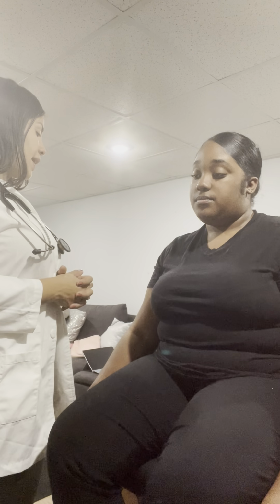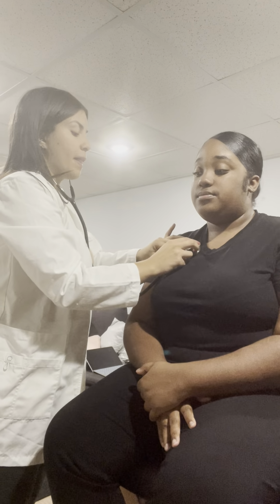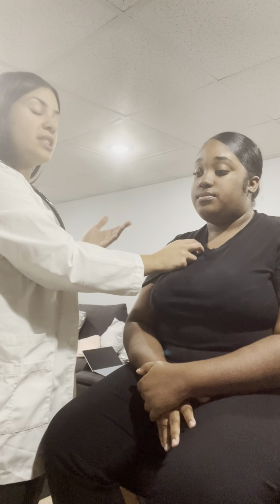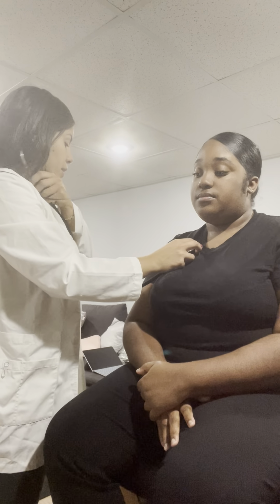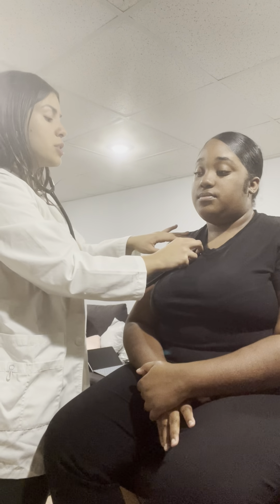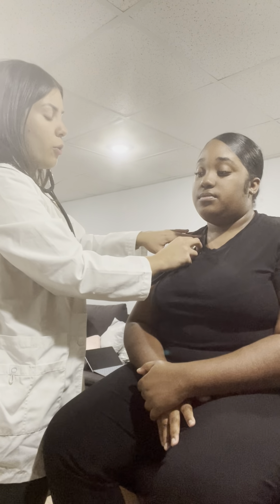From there, we're going to go ahead and check, in the posterior part, we're going to listen to the lung sounds. So we're going to auscultate the left side and the right side of the lungs. And we're looking to see if we can hear any stridors, any crackles, any adventitious lung sounds, any rhonchi. So we're going to go ahead and listen. In the front, we have 6 positions that we listen to. So we start around between the first and second intercostal space, right below the clavicles.